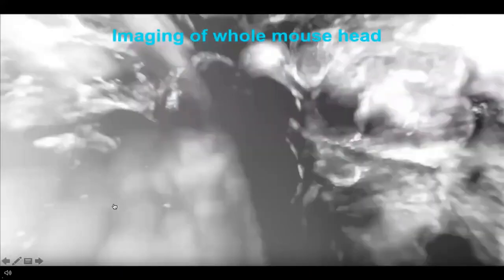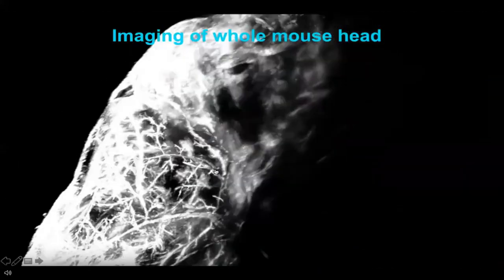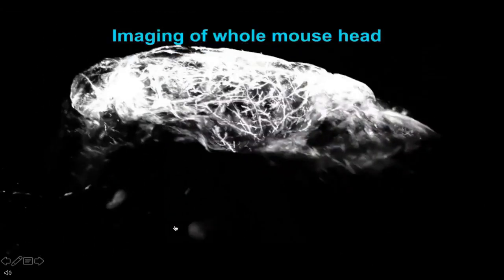Now we've injected dye in the CSF and we're moving through the head to the periphery here, from the brain to the periphery, and we're going to loop back. So we see here the brain in its entirety, and we also see some cervical lymph nodes. So this new microscope has been a big improvement in terms of technology for us.